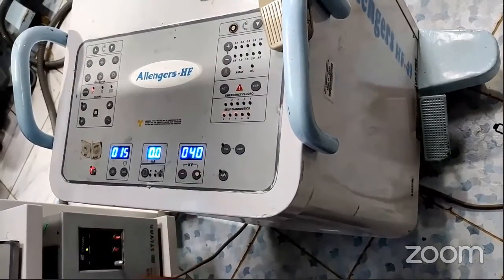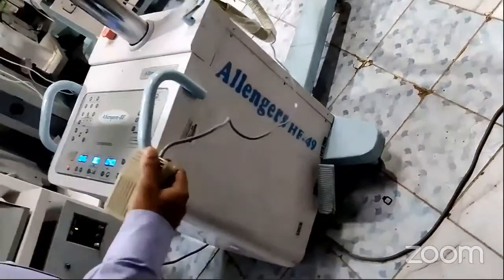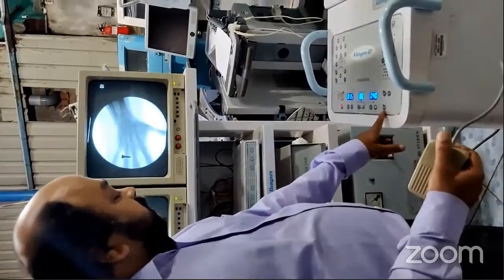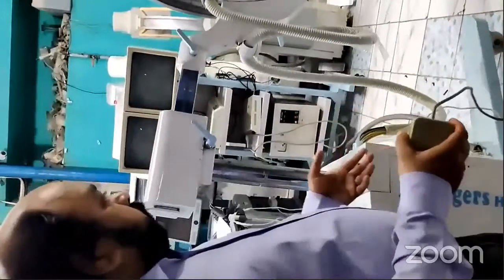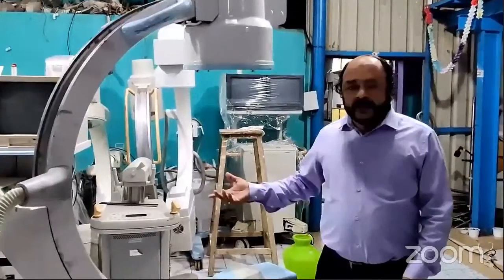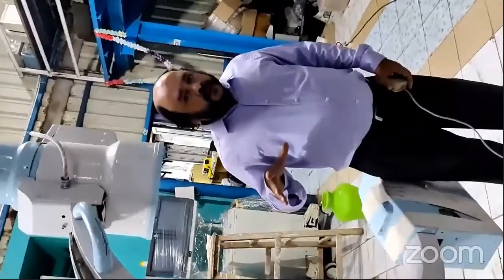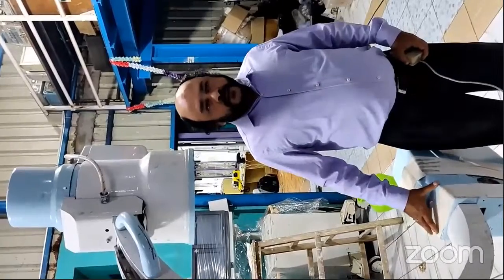Once I set the kV, this is the foot switch. You can operate through this foot switch, or the exposure switch will also be available in the system. Normally this foot switch is kept near the surgeon. Once you want to see the image, the object, meaning the patient, will be in between. The table also, sometimes they use special types of tables. Not every OT table can be used for the C-arm. A C-arm compatible table is available in the market. You can use that one.